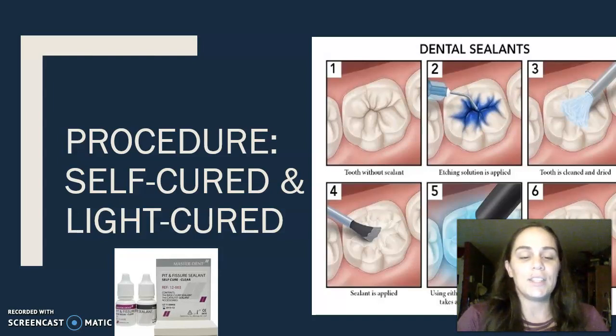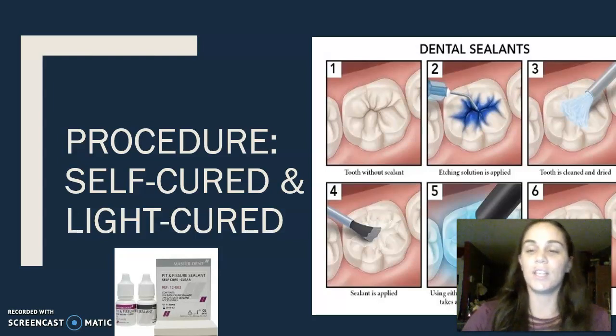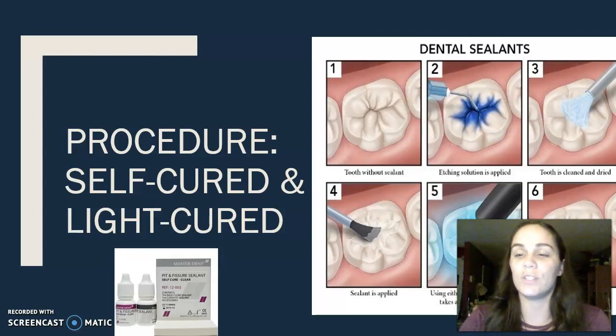You would clean the teeth, rinse thoroughly, and dry before you apply the etching solution. You let that sit for 20 to 30 seconds. Clean and rinse the tooth again. When applying the sealant, apply it liberally, but try not to use an excessive amount.